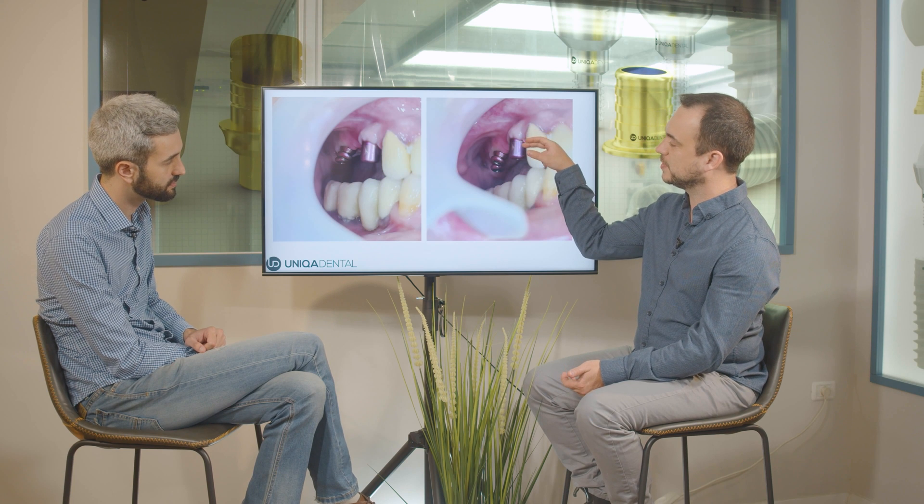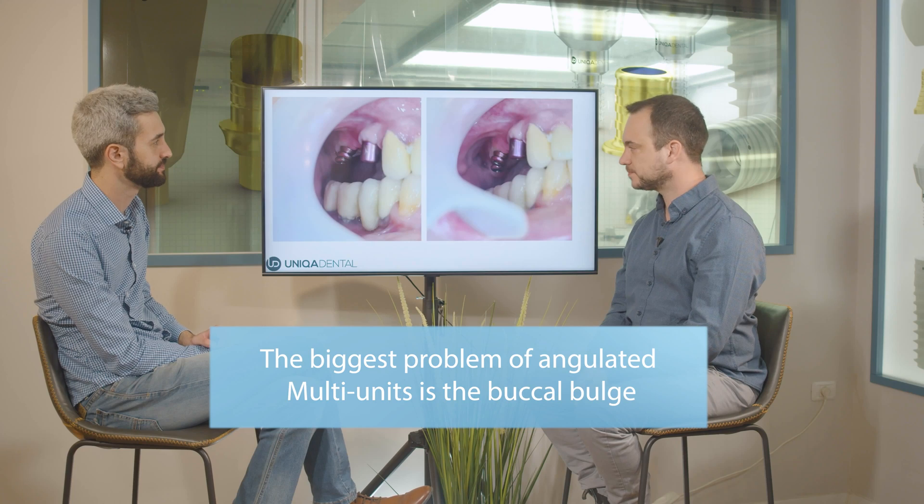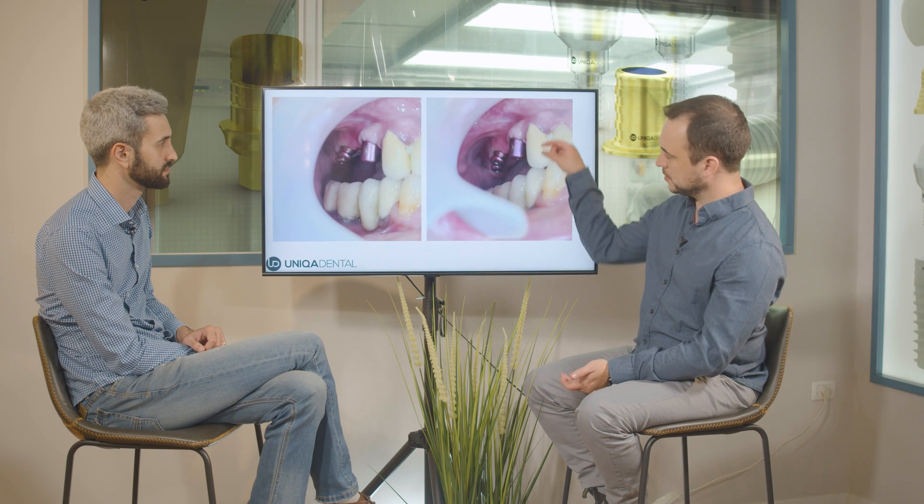So we used the angulated multi-unit, even though you can see some part of the multi-unit outside the gingiva. With angulated multi-units the biggest problem is the buccal bulge. Why didn't we use V-type here as well? You could use a V-type, but if you use a straight multi-unit you can still mill the bridge and fit it, but you'll have the screw channel in the middle of the tooth. That's quite an aesthetic problem — and it's a much bigger problem than a little bit of anodized titanium coming out of the gingiva. It's much easier to handle a little buccal bulge than a screw channel in the middle of the tooth.